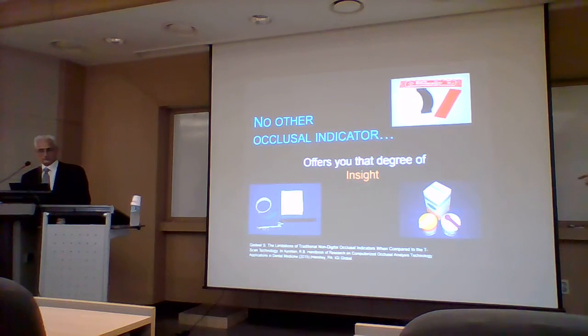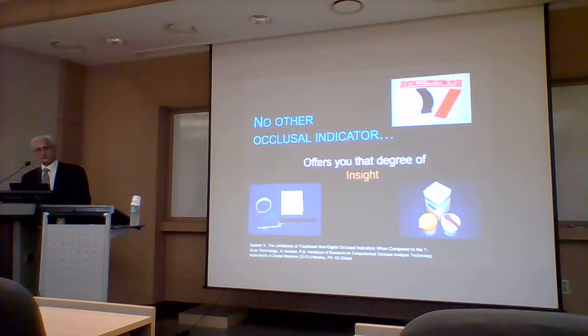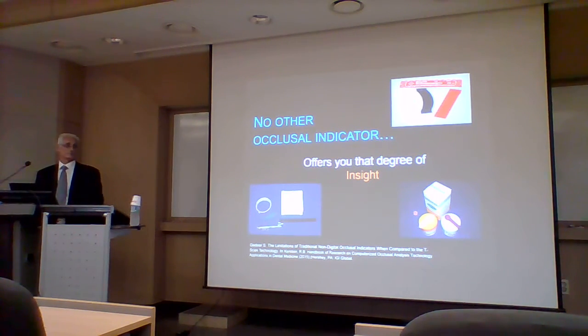What is silicone? Silicone, yes. Shim stock, articulating paper. How to use the silicone material to check... I don't use it, but essentially people make a mixture of it, put it on the teeth, have the patient bite through it, and they use, again, the biggest mark or the biggest hole being the most forceful, which of course is not true.